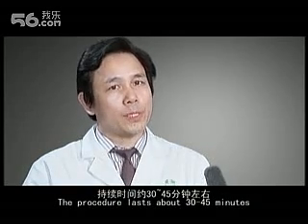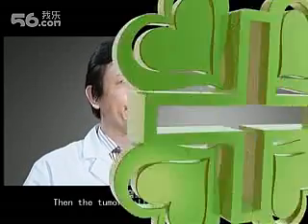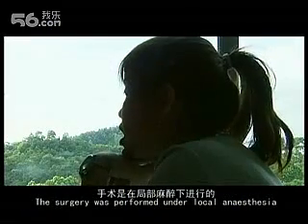The procedure takes approximately 30 to 45 minutes and the operation is performed under local anesthesia.